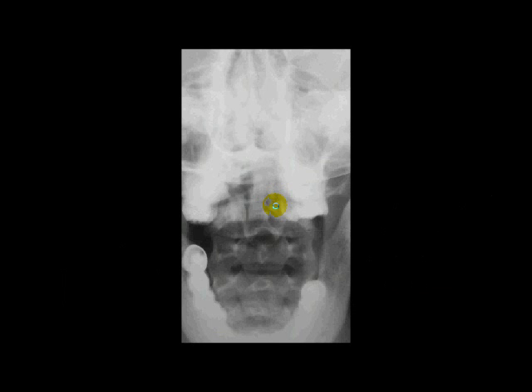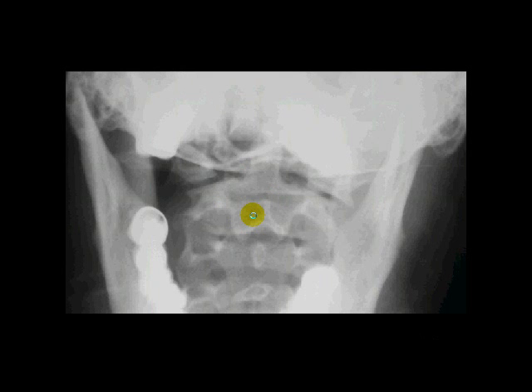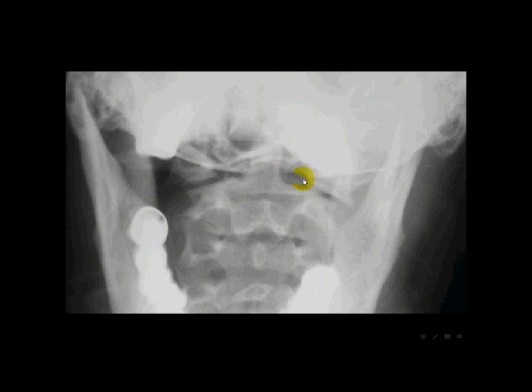For this they ordered a special view — the open mouth view — especially to look at the C1-C2 relationship and the odontoid process. Looking into the open mouth view, we see the C1 lateral masses, the C2 articular surface between C1 and C2, and the odontoid process. This gives full information about the distance between the lateral mass and the odontoid process, and it is clearly showing asymmetry between one side and the other.